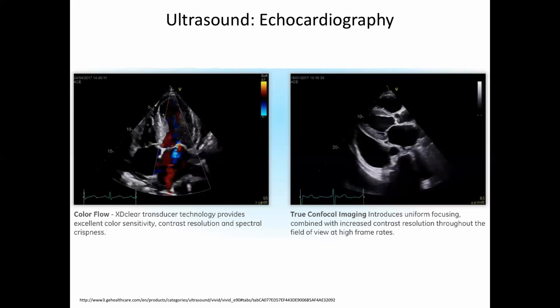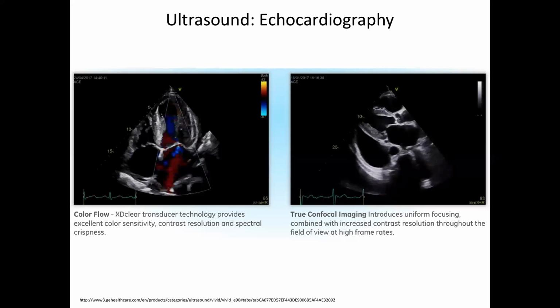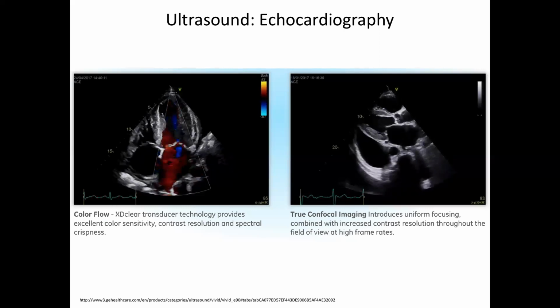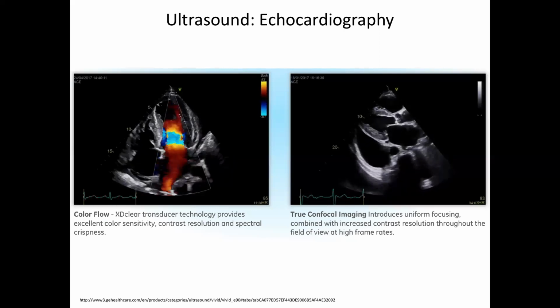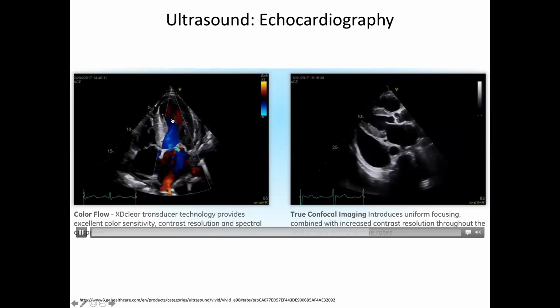And if the frequency jumped up, right? So let's say we put a 1 megahertz chirp out and then it comes back and it's got a slight increase in frequency, then you know the object that it reflected off is coming towards you, right? If the frequency of the reflected signal goes down, that means the object's going away from you. And that's Doppler shift. So what you can do is, by the timing of the reflection of the chirps, you position where things are happening, and we'll see how that works.